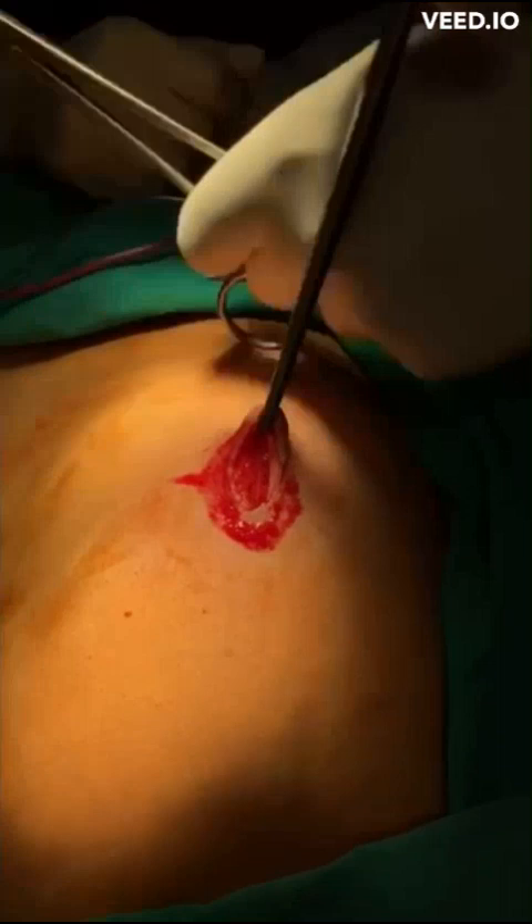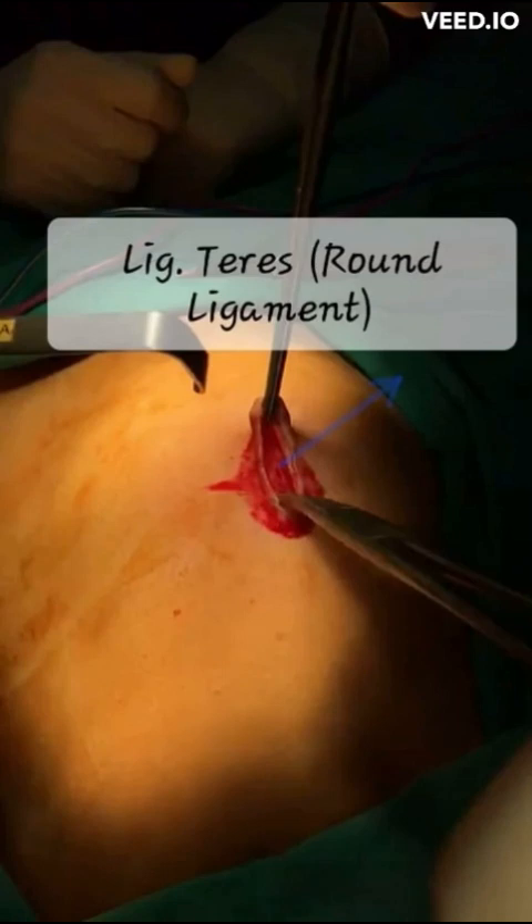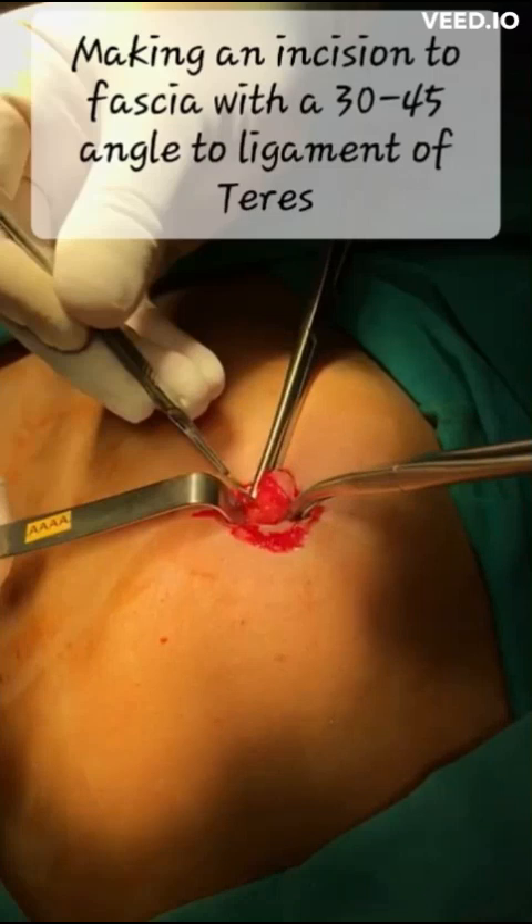Afterwards, we lift up the cranial part of the teres ligament with a curved Kocher clamp, and the ligamentum teres is easily exposed.